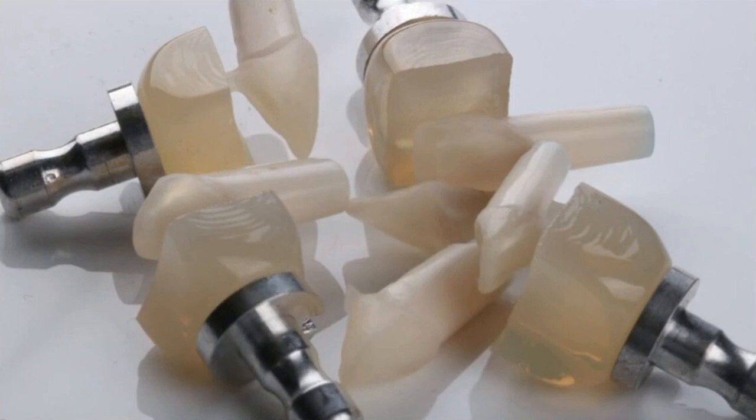For my permanent restorations and aesthetic cases, I like to use the Vita Supreme. It's a beautiful material because I think it's the only one in the market that has this beautiful opalescence, and it makes teeth look very natural. This is my preference. A lot of people like other materials, but I like this one.